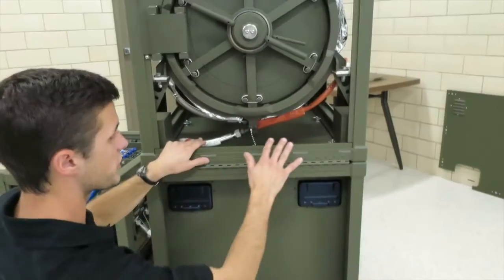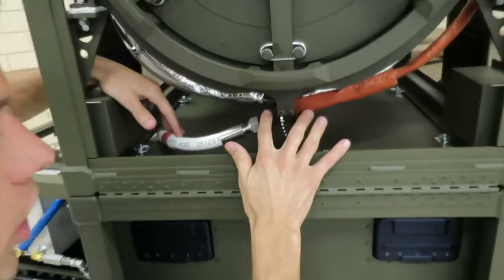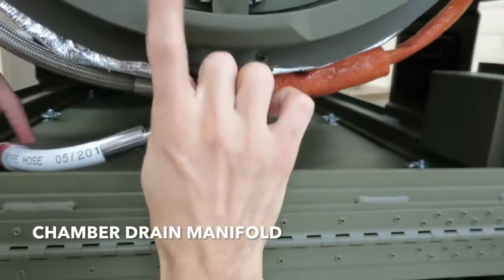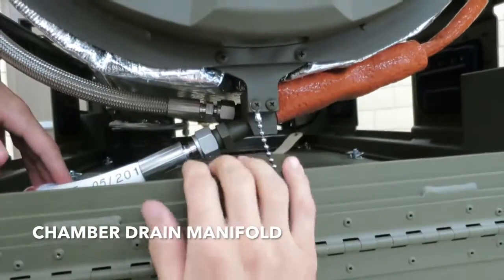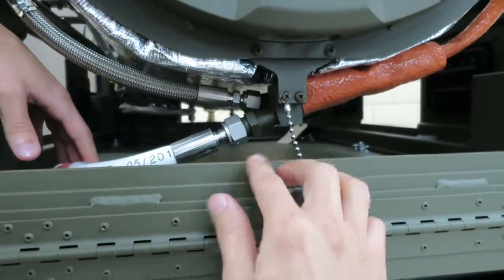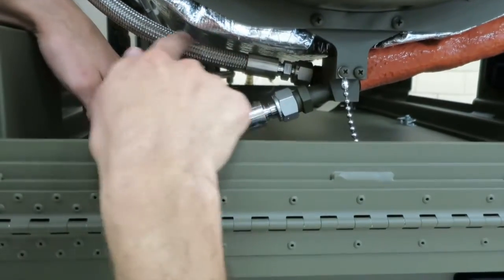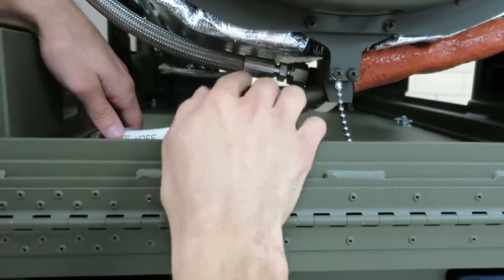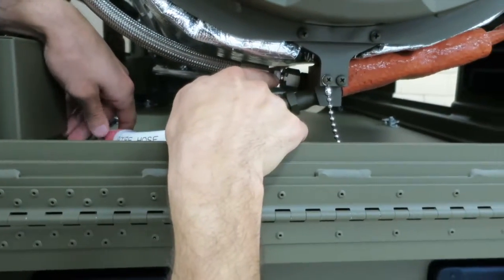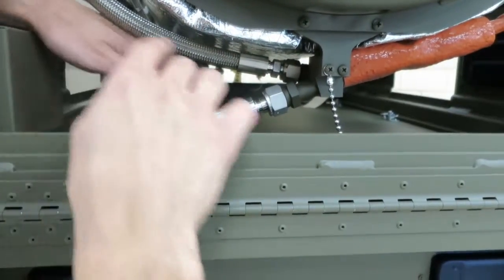On the front of the sterilizer, with this bottom panel removed, a very important part to the sterilizer operation is the drain manifold. This is mounted to the bottom of the chamber. If you open up the door and peek into that hole, you're peeking into this manifold right here. We've got three things attached to it. This hose in the back is the vacuum exhaust hose. Anytime you're evacuating the chamber of steam or air, the water recovery system is pulling that vacuum and it's being evacuated through this hose.